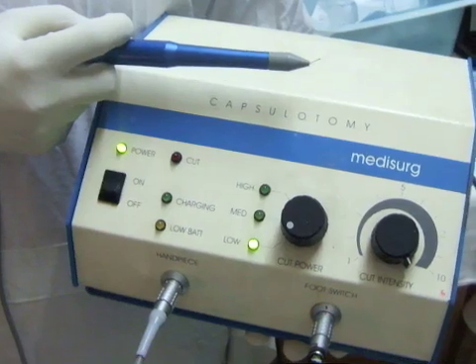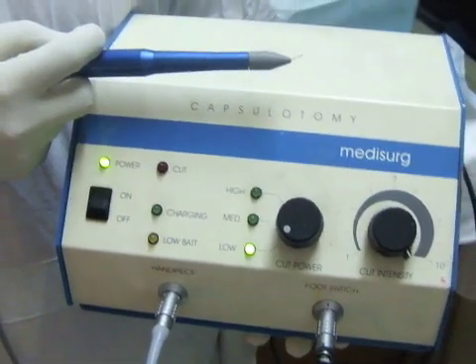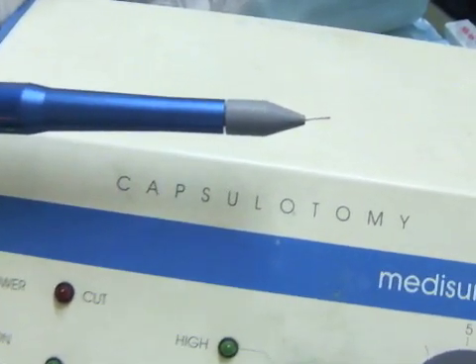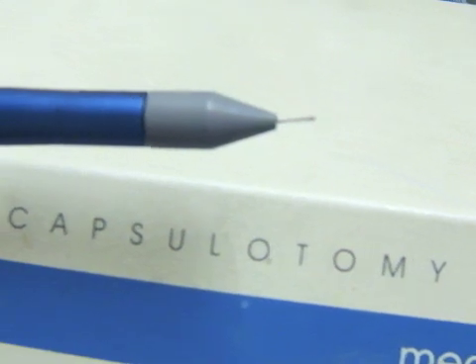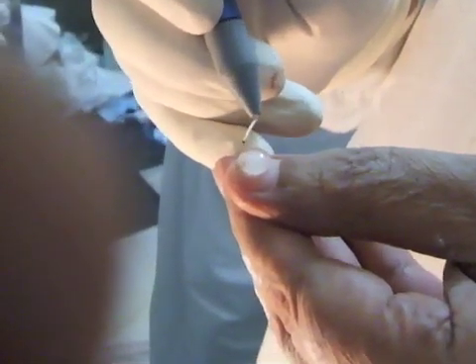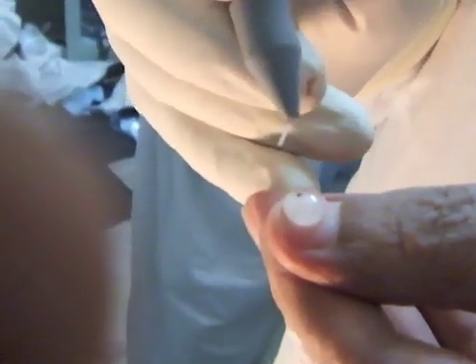There is no burning and no charring of the tissues, which is important for distichiasis. This is the Fugoblade console with a handle and a Fugoblade tip. The tip we use is 100 microns in width. When activated, it produces plasma that becomes visible. The filament is covered by yellow plasma, which is cutting, and an orange light — a photonic cloud — which is non-cutting.